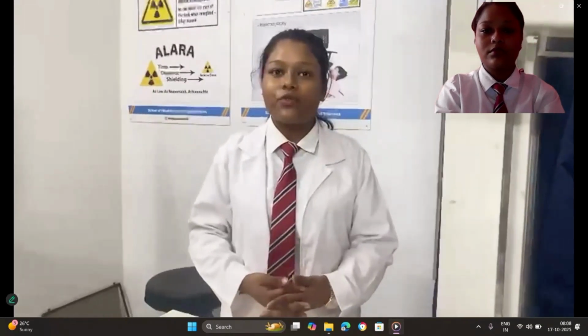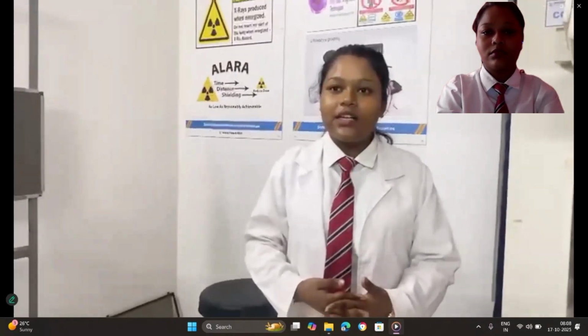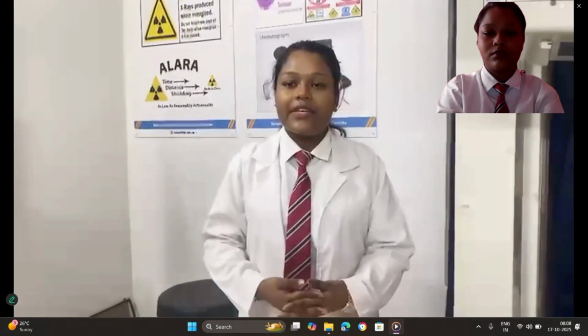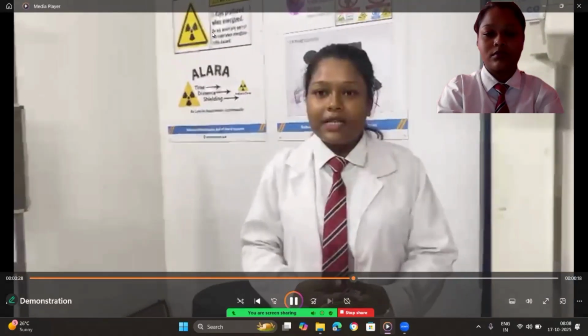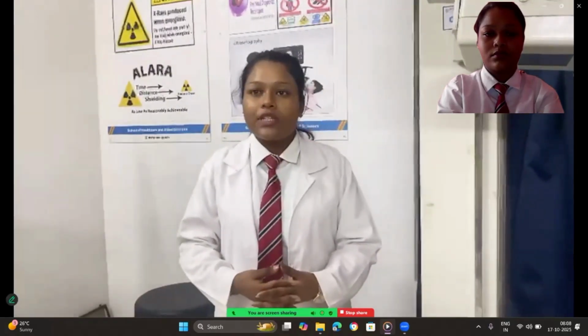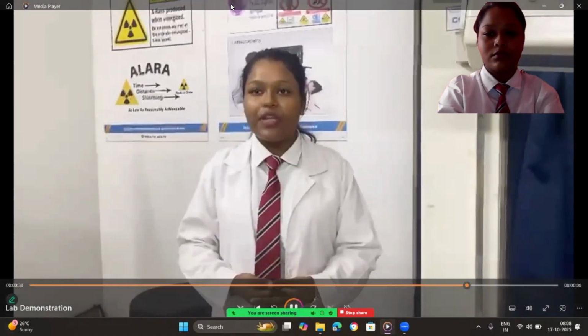The patient lies supine with legs slightly rotated inward. Center the X-ray beam at the femoral head and symphysis pubis to capture the pelvis and proximal femur. Set the machine according to protocol, adjusting kVp and mAs. Always follow radiation safety, use lead shielding and minimize exposure. Check the X-ray for clarity and correct positioning, identify fracture and document findings.